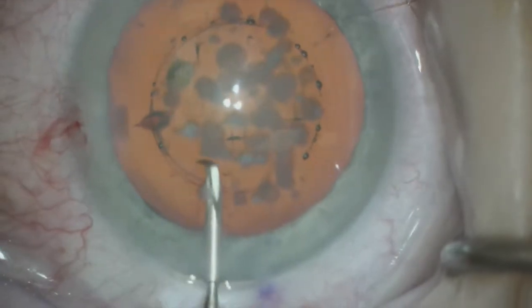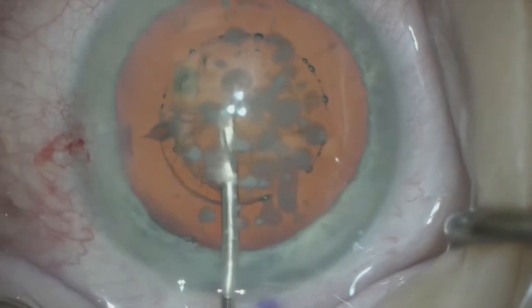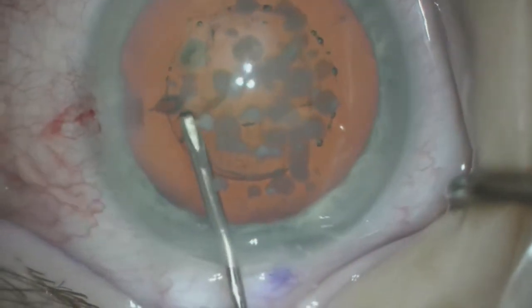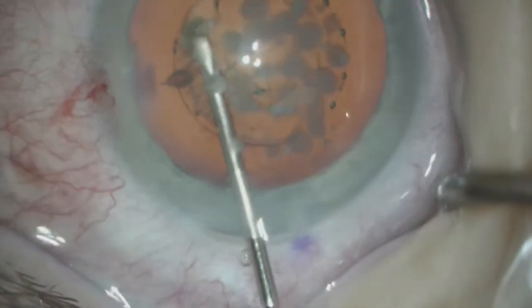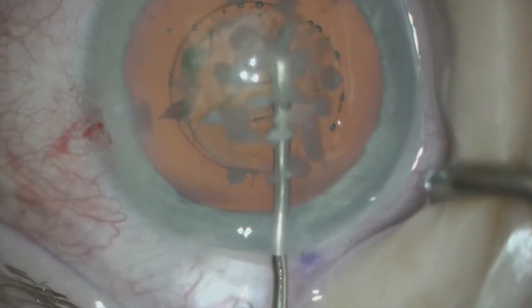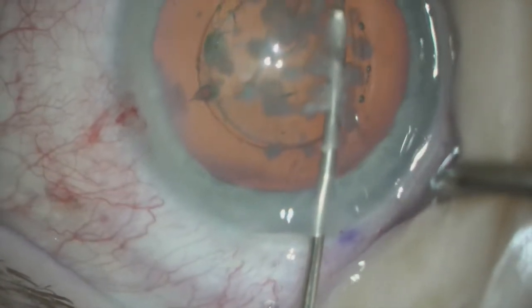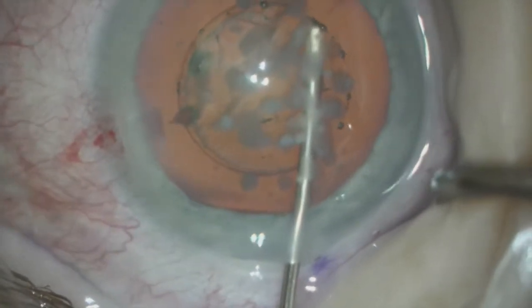Unlike most laser capsulotomies, this capsulotomy has tags that we anticipated from the granular dystrophy opacities that were blocking the delivery of the femtosecond laser. So we have to gently separate these adhesions, which are probably about 20% of the capsulotomy periphery.